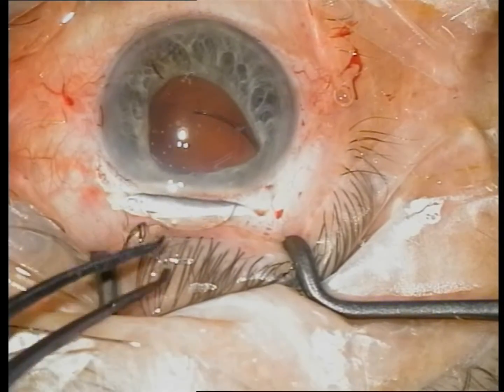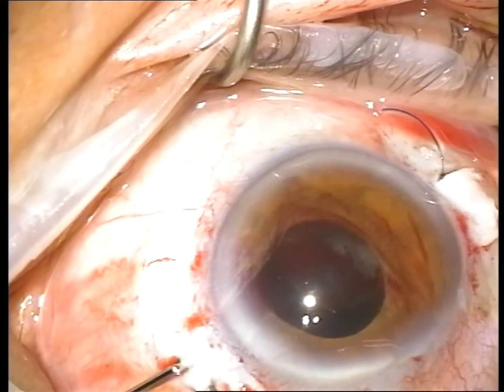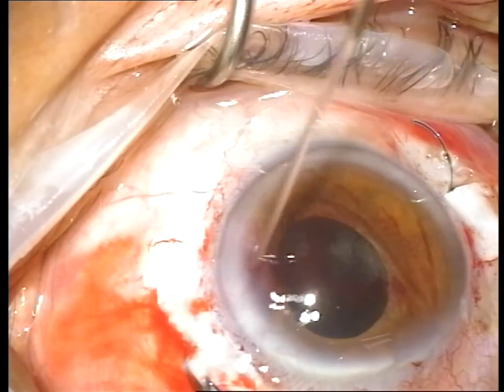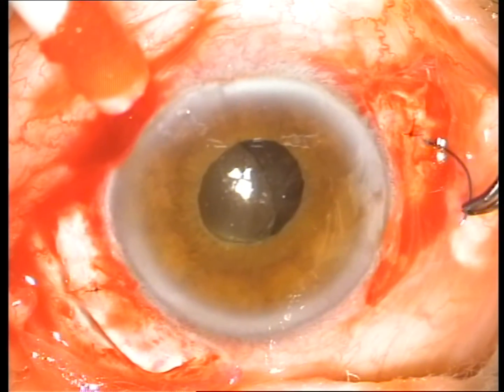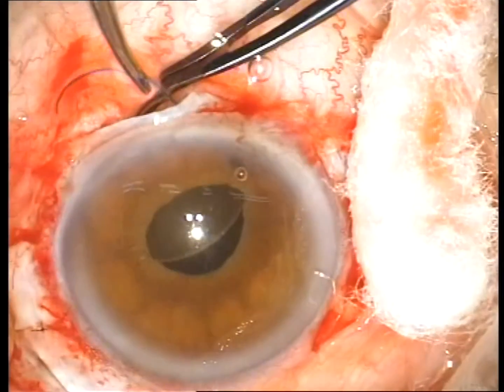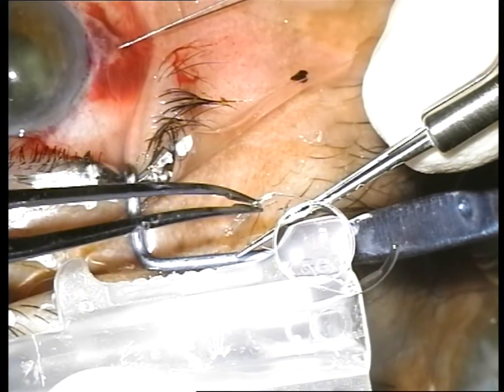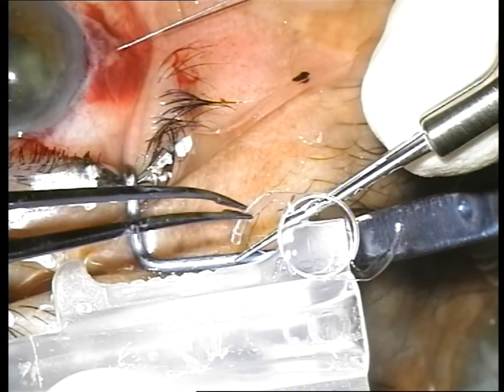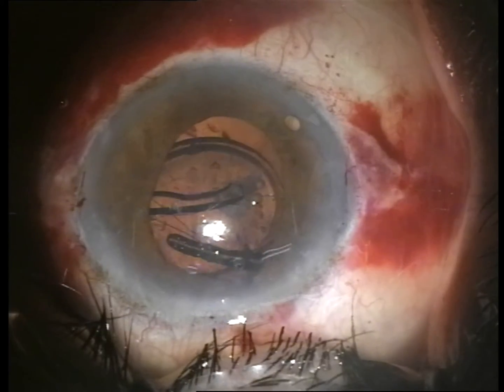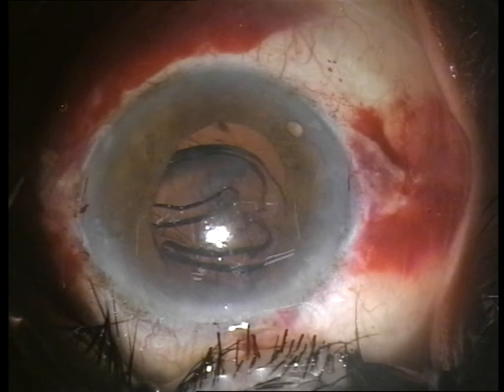White polymethyl methacrylate or foldable acrylic lenses may be used for transscleral fixation. The implantation of foldable lenses maintains the advantage of small incision surgery and a closed system, resulting in less vitreous loss, lower astigmatism, faster wound healing, and early visual rehabilitation. However, the lack of eyelets or any haptic indentation or specific haptic configuration can lead to suture slippage, entangling, and IOL decentration.